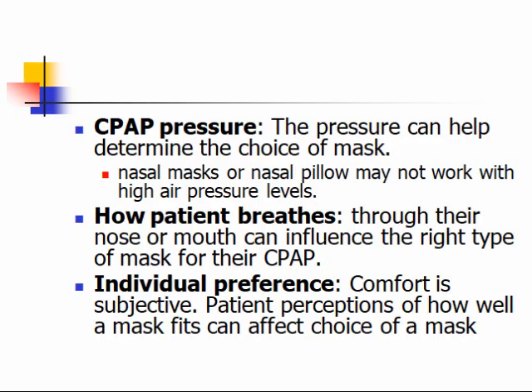Unfortunately, some companies that provide the CPAP supplies only have one style of mask, and it limits what the patient can try on and use. So it would be great if the company would provide all kinds of different masks for the patient.